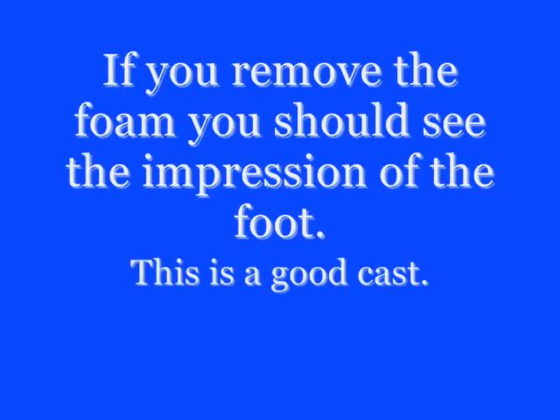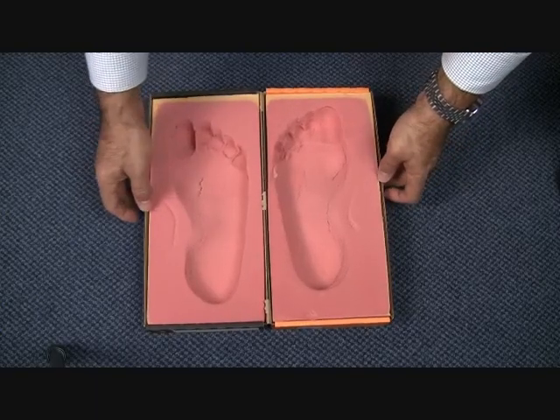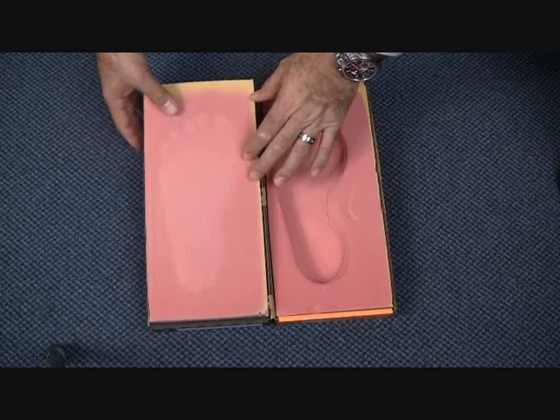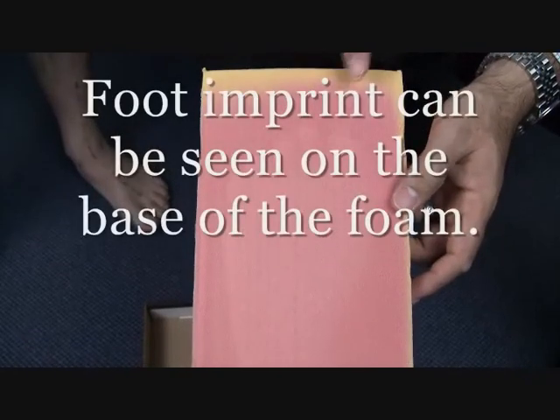The heel, fifth metatarsal, and first metatarsal areas should be completely depressed to the base of the foam. If you want to check your casting, take the foam out of the box and check to see whether you can see the actual impression of the foot coming through to the base of the foam. You can see here that the foot is clearly visible.